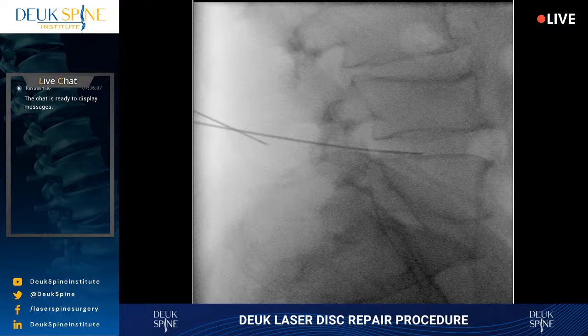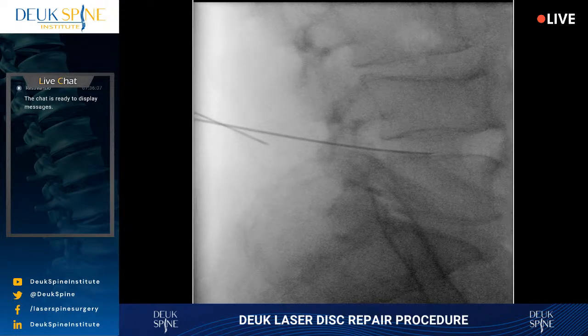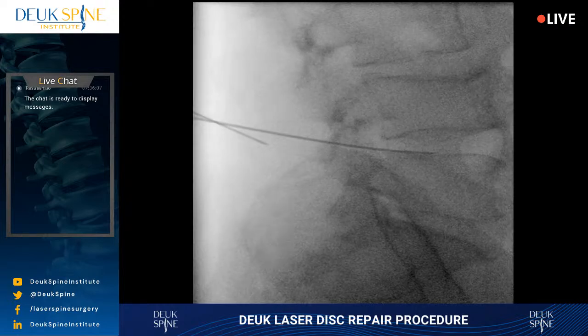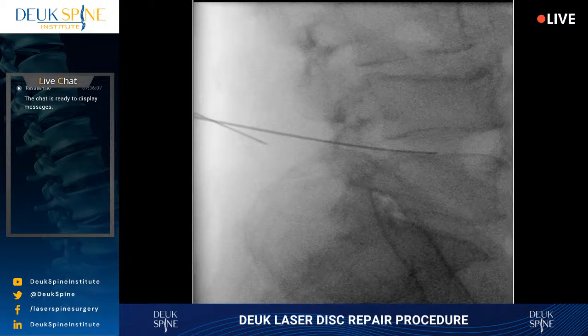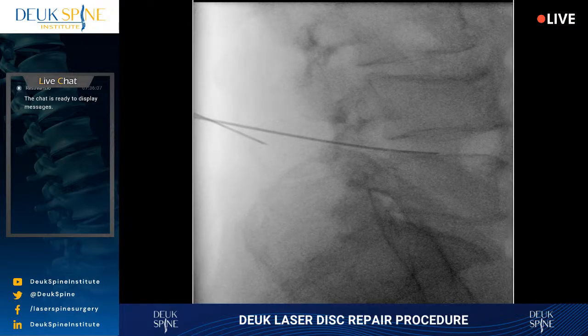So give us a minute to get our navigational information right. This would be like navigating on a boat at night 200 years ago, 300 years ago. It would be like using the stars and a sextant. So you're using reference points to navigate. And our reference points are the bones of the spine. And everybody's bones are a little different. Some are bigger, some are smaller. So we need to line the bones up properly in order to get a good view of the place where we're trying to go.